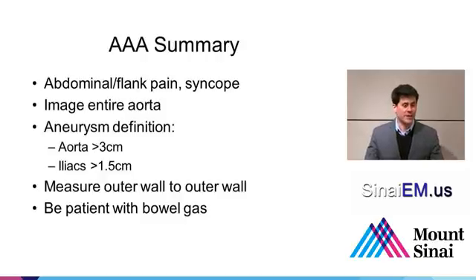And finally, the biggest enemy for you is going to be bowel gas. So make sure that you're either patient with it, let it scoot away through peristalsis, or apply slowly, gently pressure, or wiggle the probe around to move it out of the way. And try to seek a window where there's not bowel gas in your way.